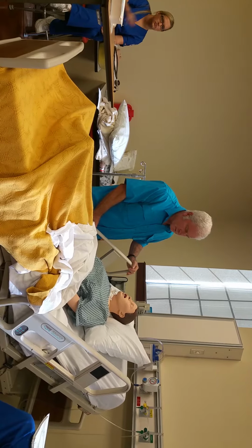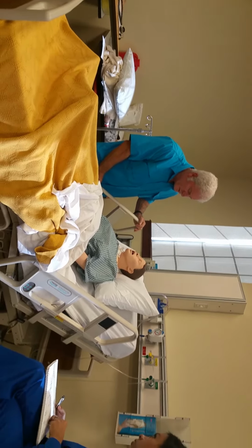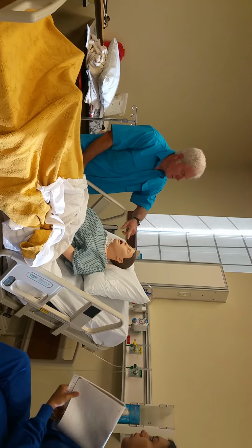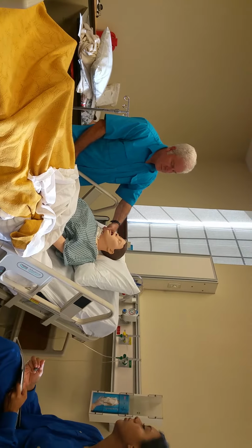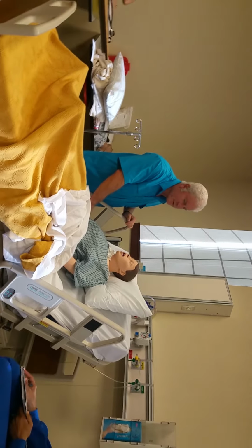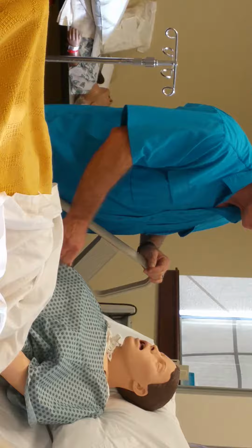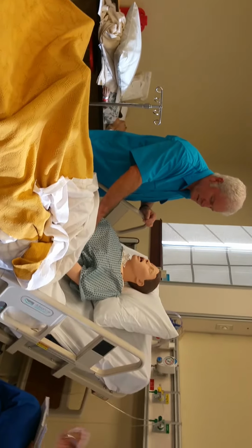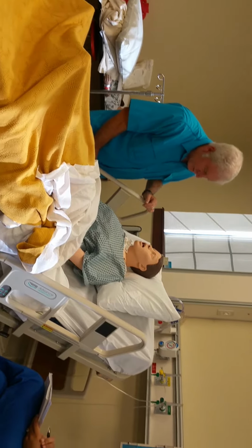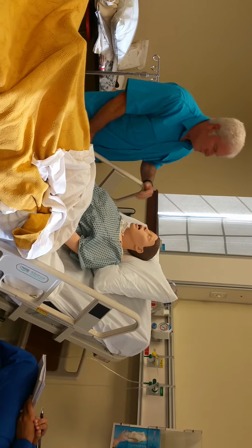I'm going to set you up here a little bit. Do you know what an NG tube is? No. Well, you're going to have to put a tube in your nose, and it's going to go down your throat into your stomach, because that's probably why you're having all this pain. Something's going on in here, and it's basically going to suction out your stomach, and it should relieve a lot of your pain down here. Oh, that doesn't sound like fun. No, it's no fun at all, to be honest with you, okay?